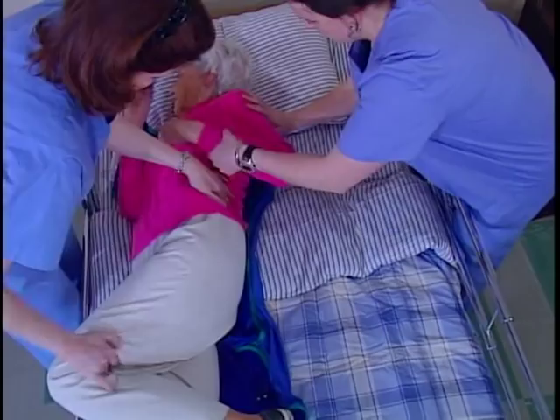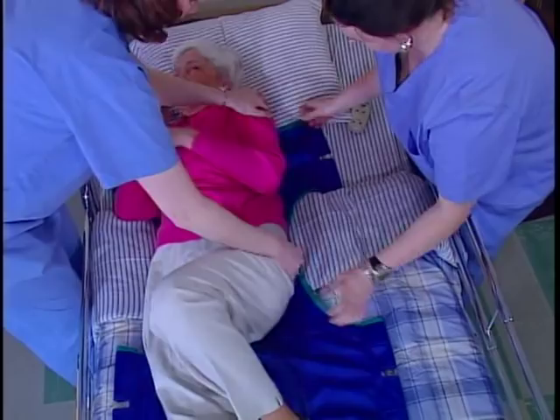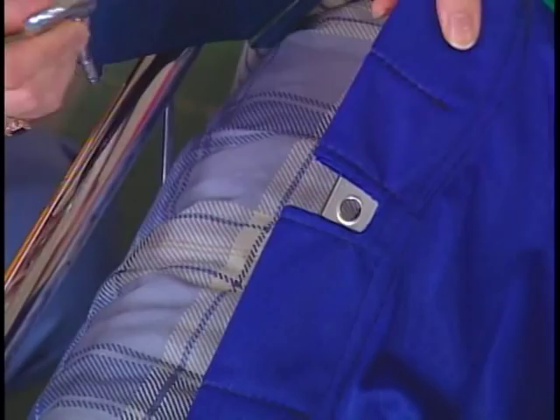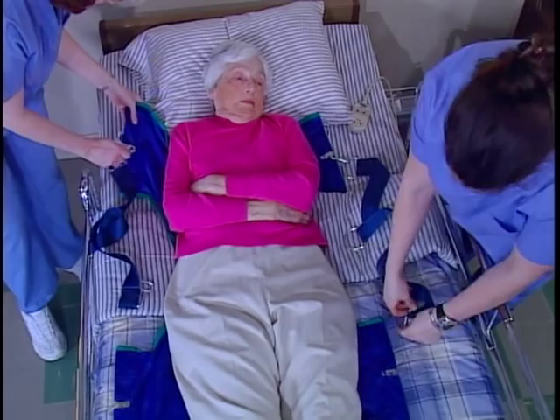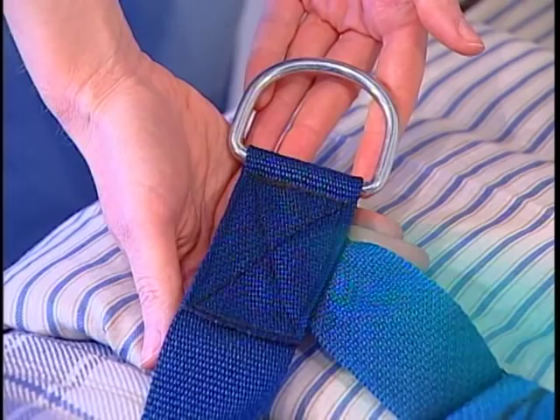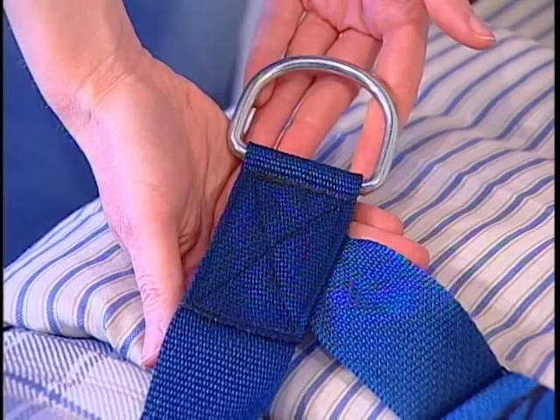Attach the chains or straps. For this demonstration we'll use straps, but the procedure is the same for straps and chains. Insert the S-hooks through the support bars so the open end is away from the resident. You'll notice that the strap is intersected by a D-ring — place the short section toward the resident's head and the long section towards the legs. This setup will give the resident the most support and comfort during the lift.